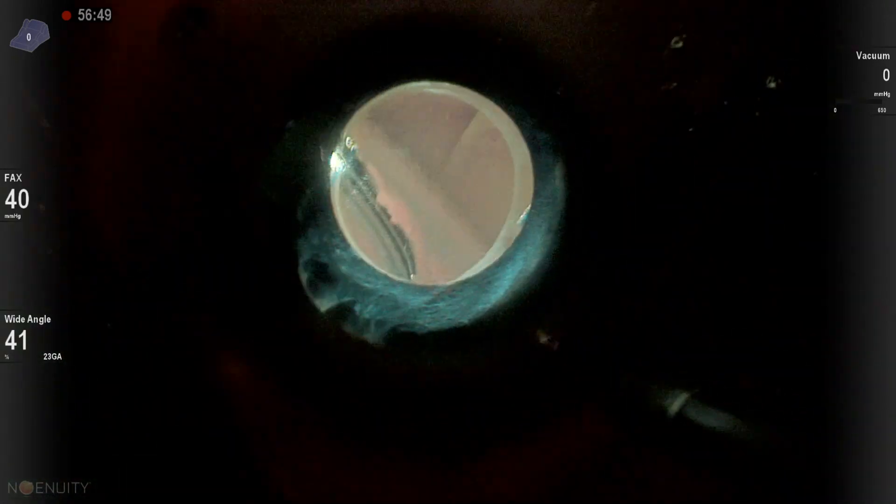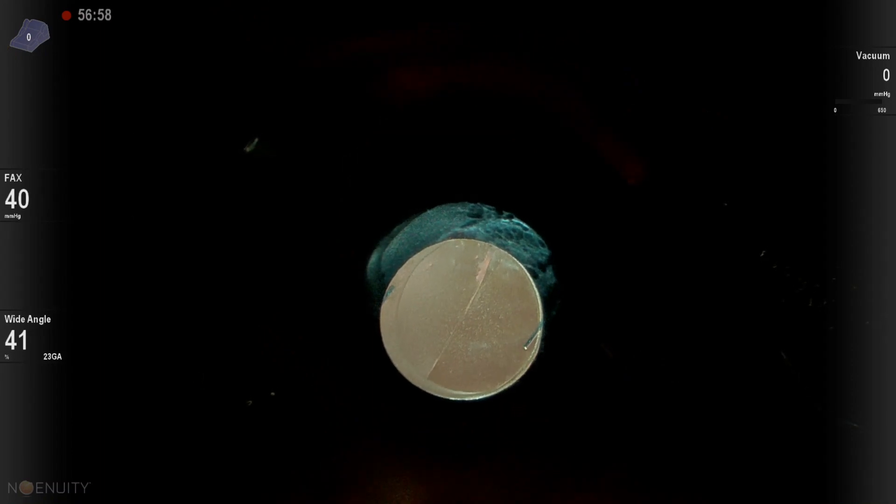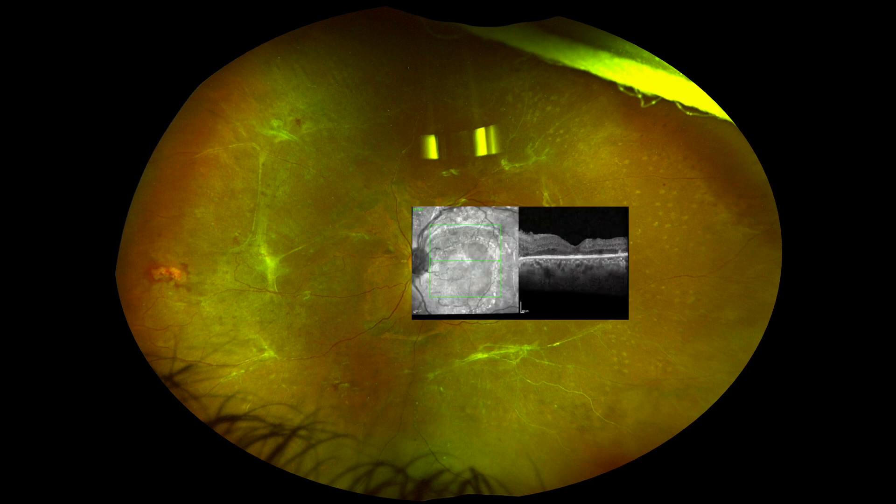I did not want to completely fill with air because I thought if I go to the disc and drain, the retina will be displaced. So I only drained enough to just close the ports. This is one week after the surgery with the retina much better attached, and there's the OCT.